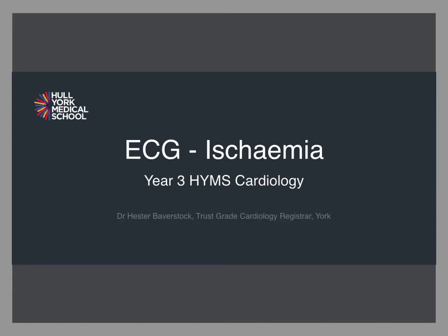I hope by now you've gone through both my talks on ECG key concepts and the talks on rate and axis. Now we're getting a bit more to the juicy bit, thinking about looking at diagnosing pathology and serious pathology from an ECG.